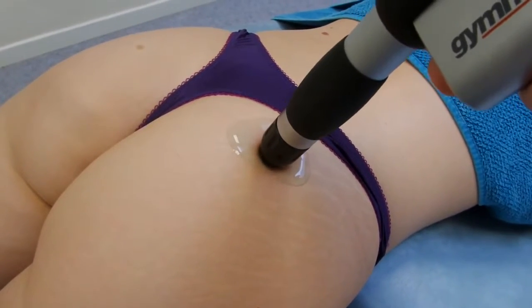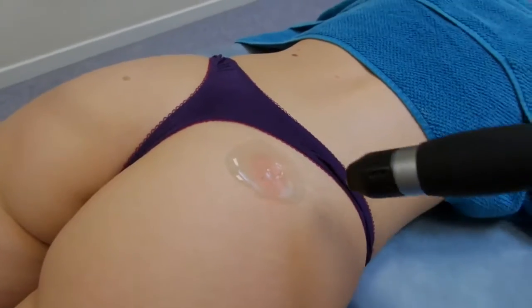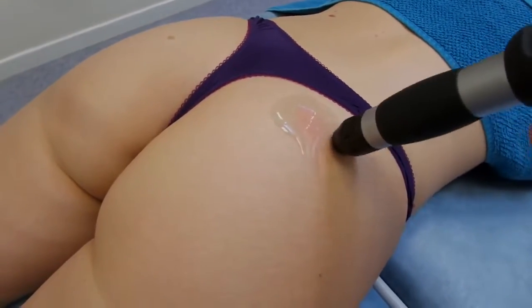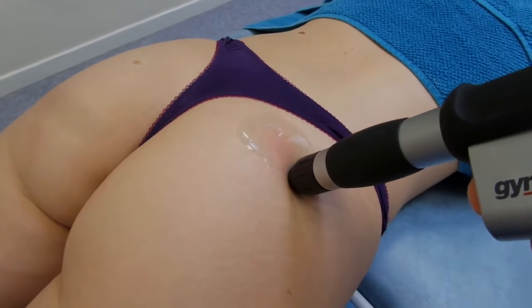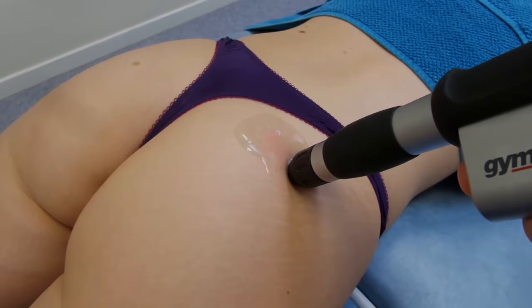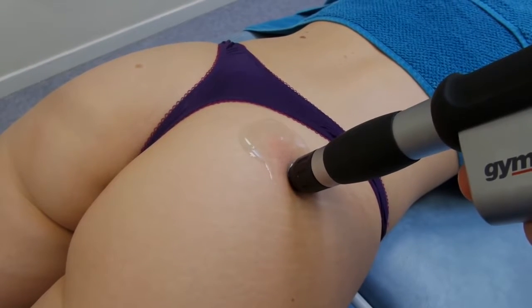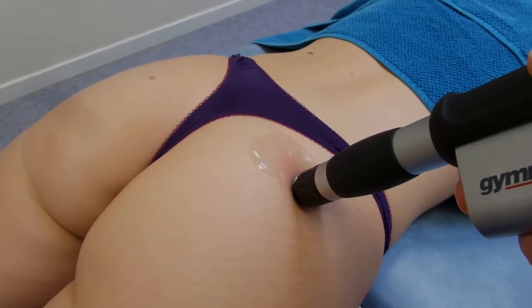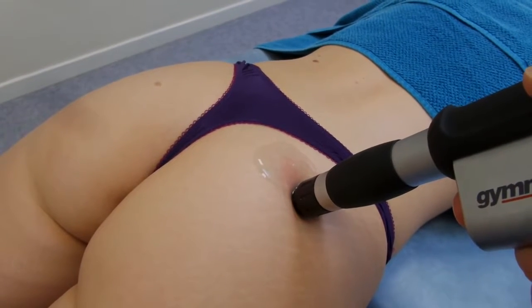You see the redness, the erythema building up from the treatment. Once we've done 200 shocks, we'll move down to another area and do 200 shocks on another trigger point. We tend to go for the area that's the most painful. So in this case, 2 spots around the piriformis and a spot down into glute med.